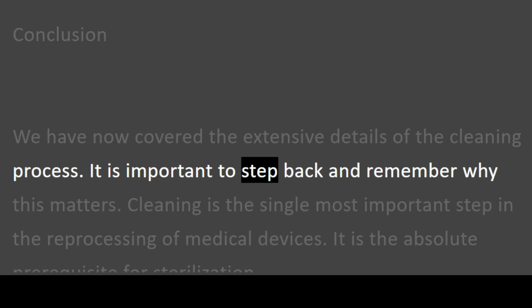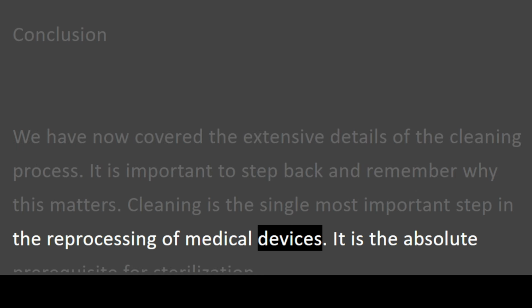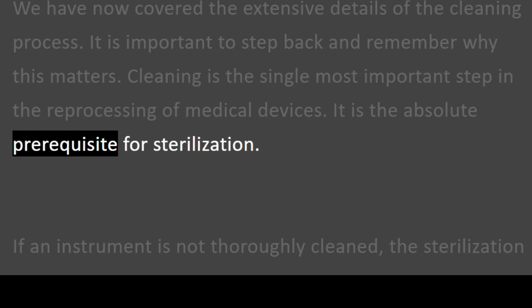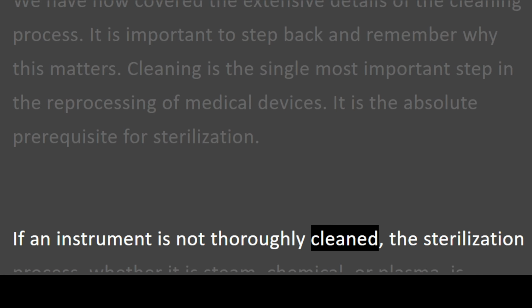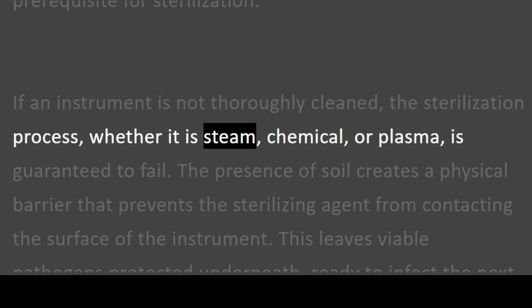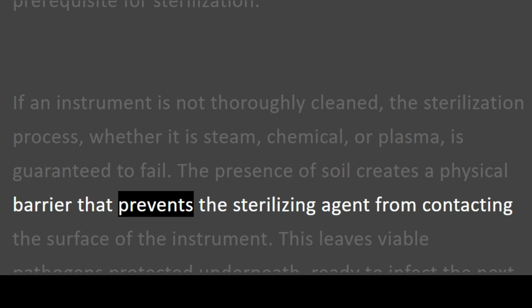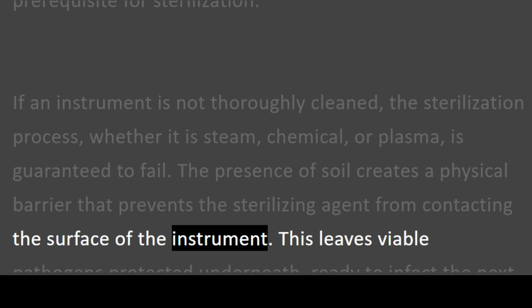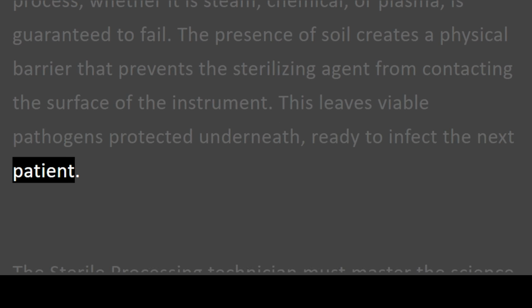Conclusion. We have now covered the extensive details of the cleaning process. It is important to step back and remember why this matters. Cleaning is the single most important step in the reprocessing of medical devices. It is the absolute prerequisite for sterilization. If an instrument is not thoroughly cleaned, the sterilization process, whether it is steam, chemical, or plasma, is guaranteed to fail. The presence of soil creates a physical barrier that prevents the sterilizing agent from contacting the surface of the instrument. This leaves viable pathogens protected underneath, ready to infect the next patient.